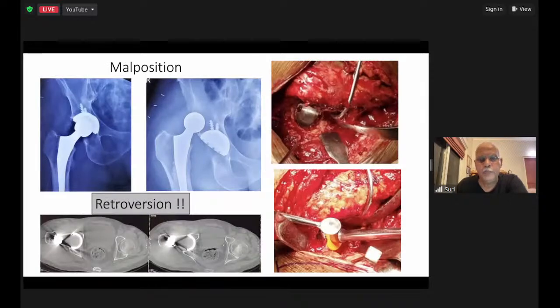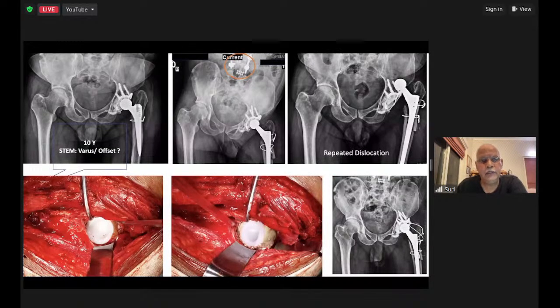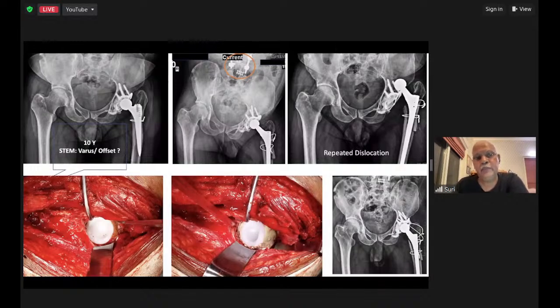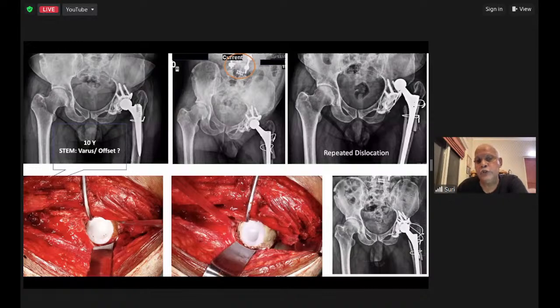Malposition can be subtle; if needed, resort to a CT scan to identify component alignment and position. For example, on a clear AP view you may appear neutrally verted rather than antiverted — this needs to be studied on CT. One case: a gentleman at 10 years with a subsided JRI Miller stem. Revised for stem subsidence — the acetabular side was not revised as it appeared intact. The patient subsequently dislocated repeatedly twice in three weeks. On review, there was spinal instrumentation at the lumbosacral junction and the acetabulum appeared neutrally verted or slightly retroverted.